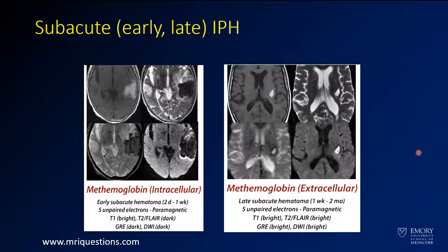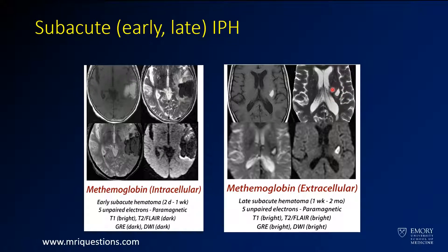As it transitions to subacute, you get development of methemoglobin. On the T1-weighted image in the upper left corner, it has become bright — you're now seeing that methemoglobin. The T2 appearance tends to vary based on how hydrated that hemoglobin is. Over time, the hemoglobin comes out of the red cells, is exposed to more water, and becomes brighter on T2. So here, as it's getting a little later, it's brighter on T2.